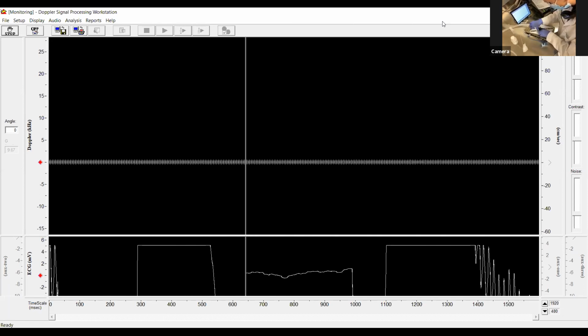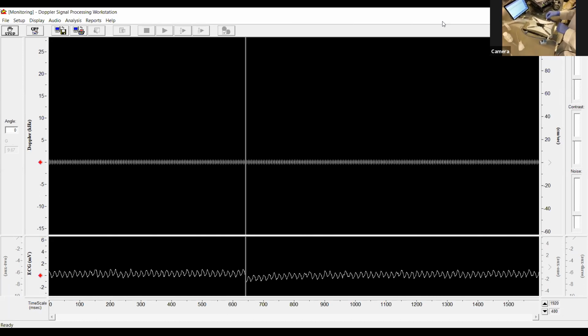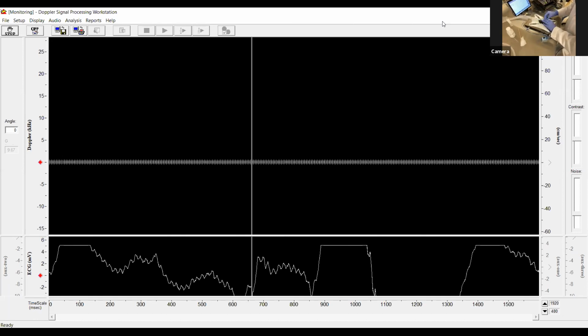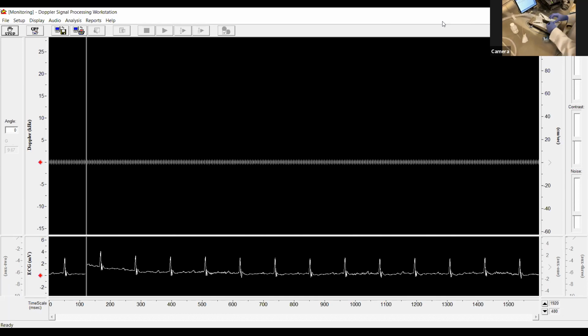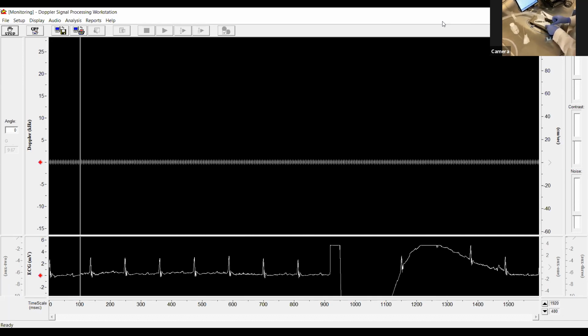Perfect. So once the paws are taped down, we'll start again with that mitral valve signal. We had pre-scanned one of the animals in the cage. This isn't the same one that we did already. And the mitral valve flow looked fantastic. So we're hopeful that our signals will be, as they normally are, easy to acquire and not giving us the challenges of that last mouse.